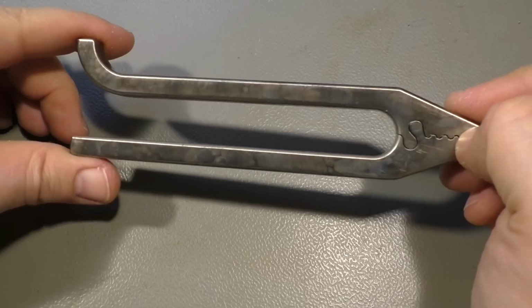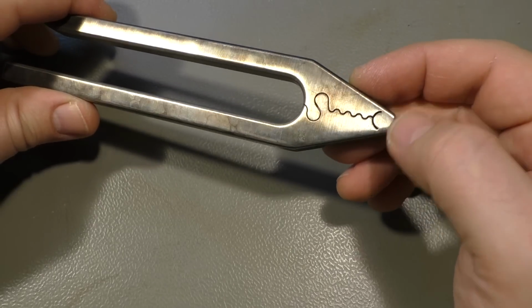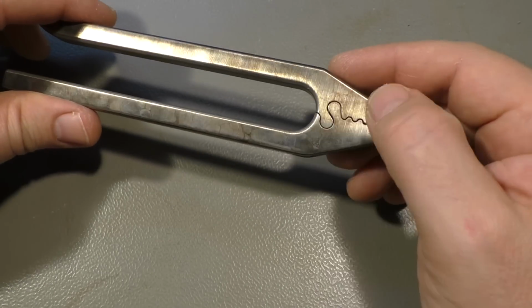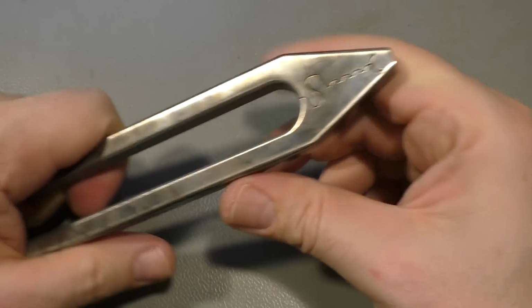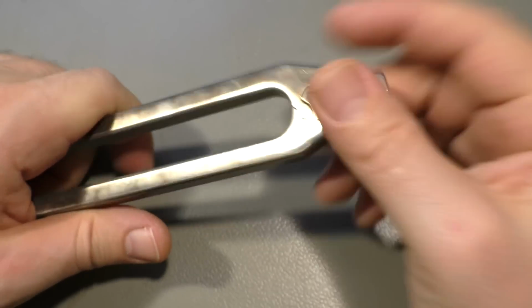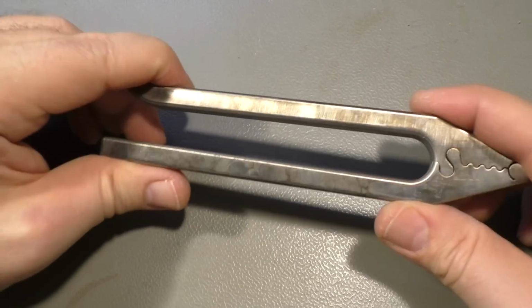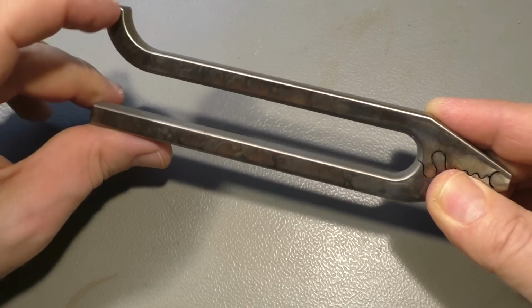That piece of pliers fascinates me most because it's only one piece, laser cut. You can move it a little bit and hold a wire quite tightly, and you also can pull it. That's why this has this angle here.